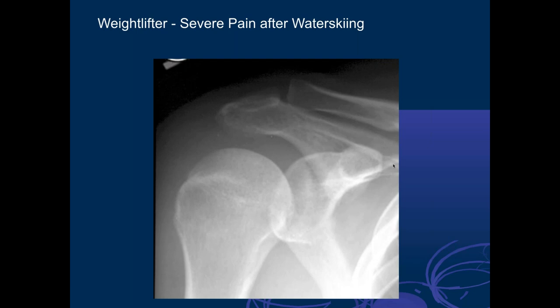Are those real little hyperdensities in the shoulder? Or is that artifactual? These little things here? I don't know. I think it's artifact. Okay. Yes, so this is fine.